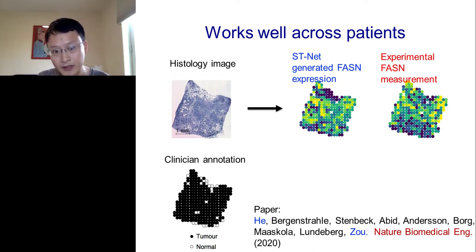And this is also quite interesting here, right, because with the standard clinical annotations, the pathologist would say that this entire image is almost uniformly made of tumor regions. Whereas the algorithm is able to detect that even within all of these tumor regions, there is still substantial spatial variation in the expressions of these key tumor genes and these key markers. And that can be very useful for more fine-grained and more precise prognosis, as well as for treatment planning.